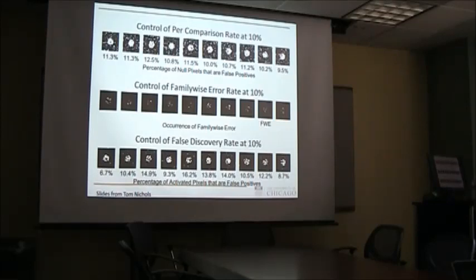In this case, significant would mean a little white dot and black would be not significant. So what you would see is that by not using a correction method, you're going to keep most of the stuff that was originally signal, in the middle. But you're also going to get a lot of stuff outside this little red border, which you knew in this example was just noise.